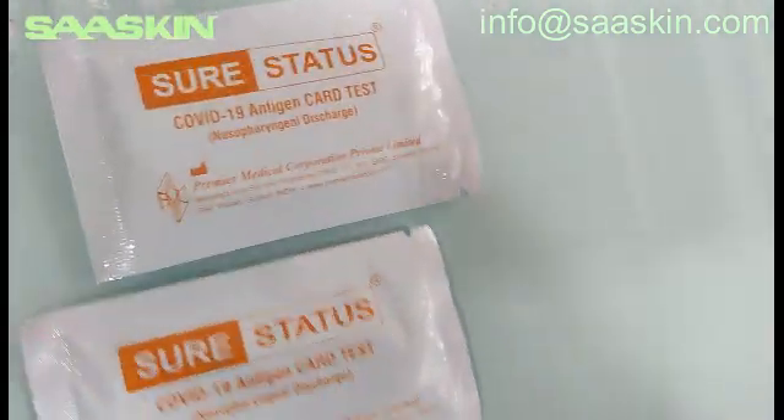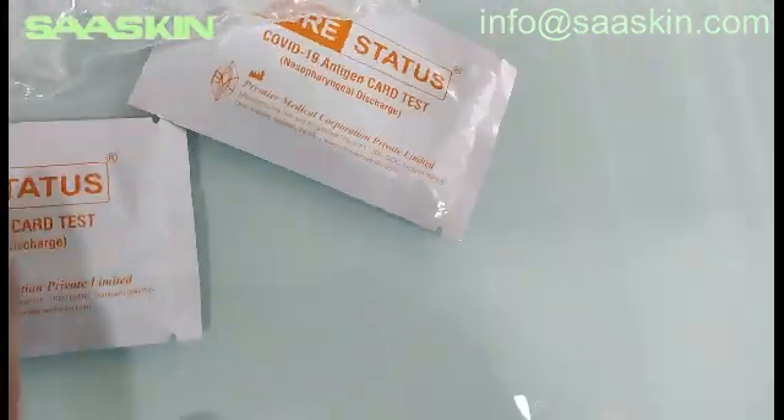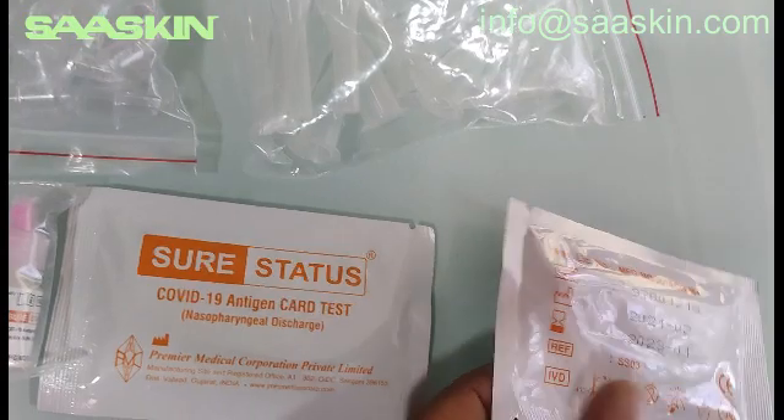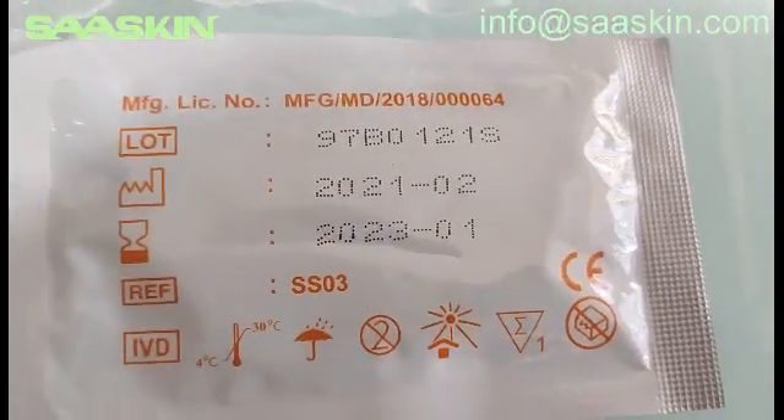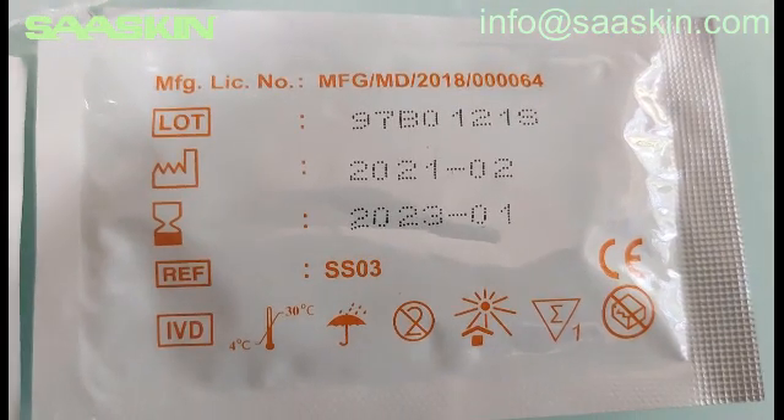Let me take two test cases for you. Here is how the test cassettes will look like — this is the front side and this is the other side. Typically you can see this kit has two years validity.